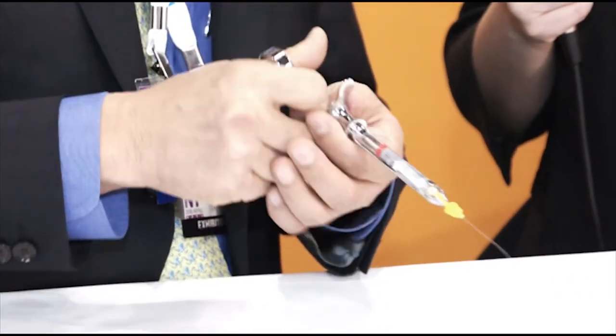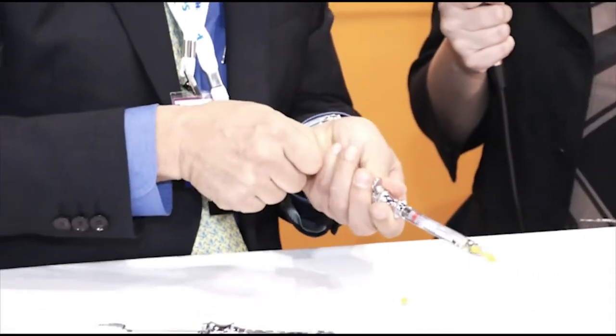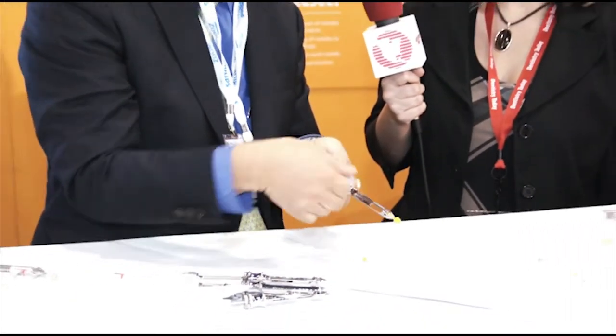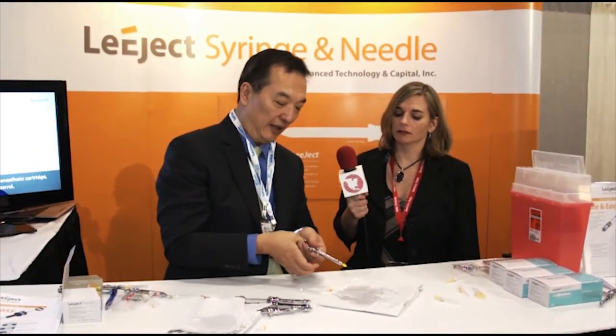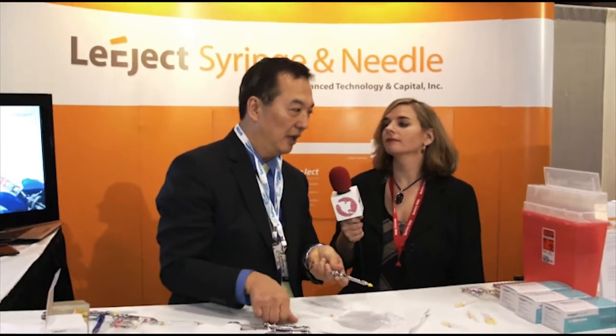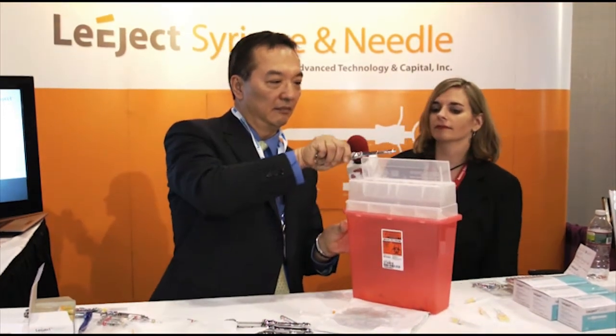So, after injection, you remove the harpoon and take out the cartridge. If you need to inject more, place another cartridge and inject more. And if you need still more, you can place another cartridge and inject more. Then at the end, you remove the cartridge, and the needle goes into the sharps container — like this.